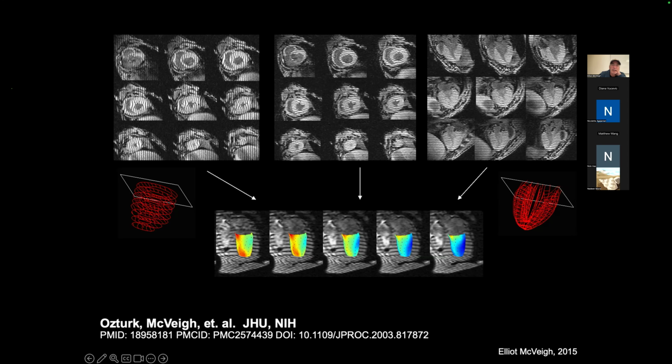And we've encoded left-right displacement with these lines. So you just get a segmentation program to go through here, pick out all the voxels that are along these lines and map those into space. Okay. And we have the left-right displacement. That's what this information gives us.